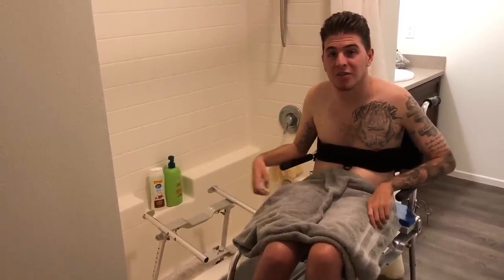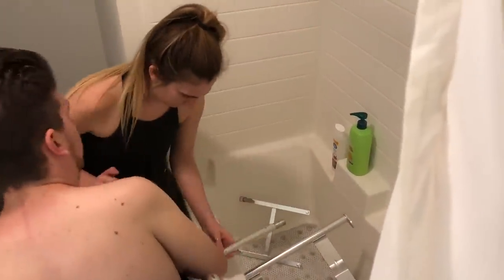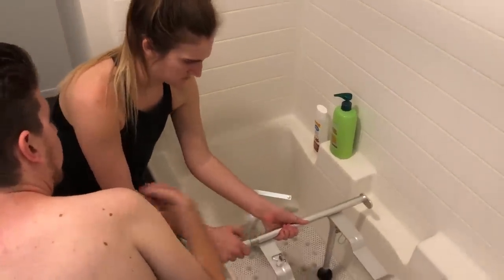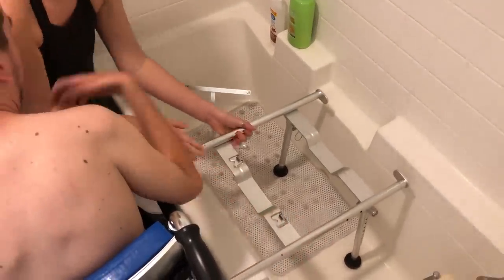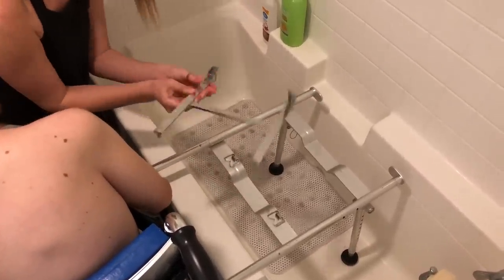So my girlfriend is gonna put these two metal rods into the commode chair and then connect them to this second device, and then once they're pushed in we just push it all together and then there's one more piece to connect.